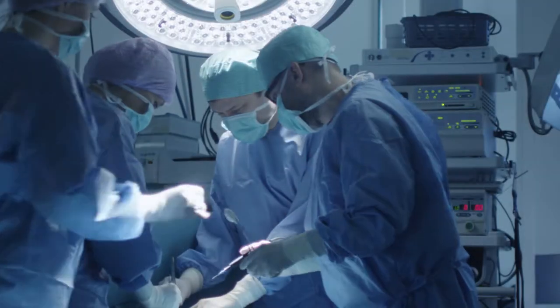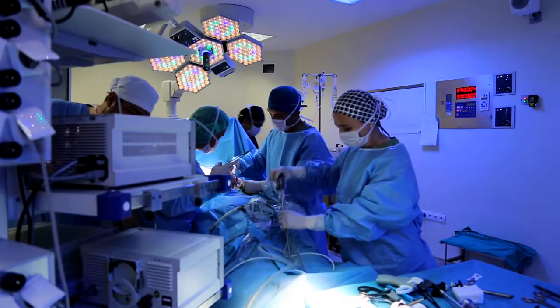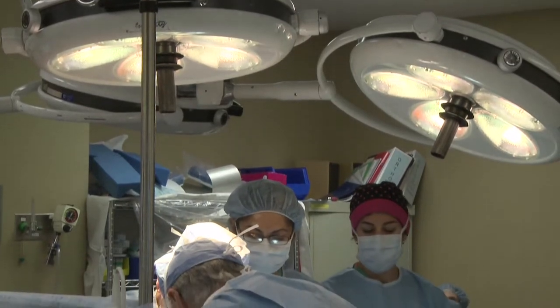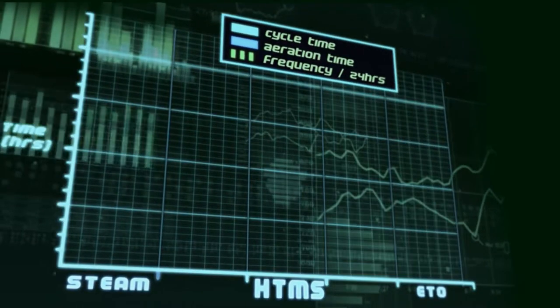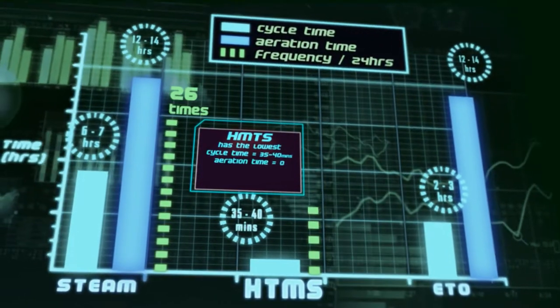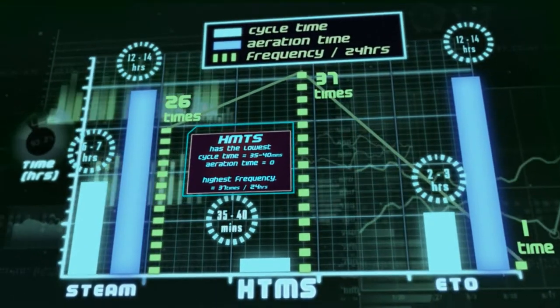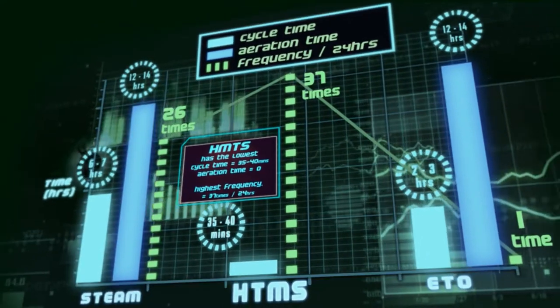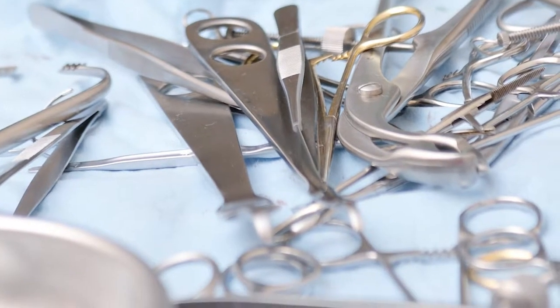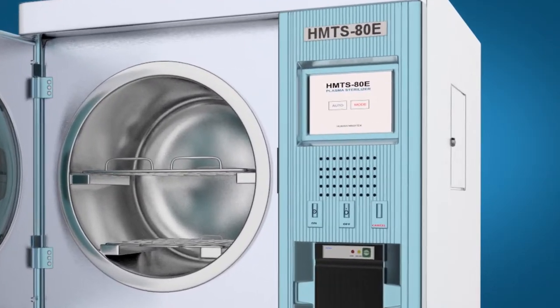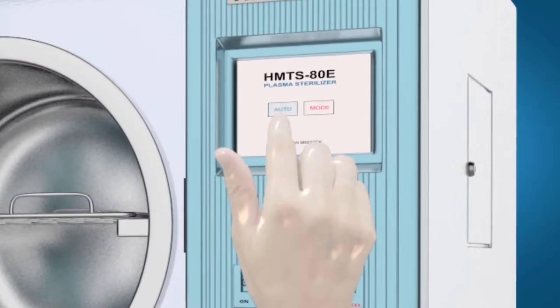Today's medical industry, where minimally invasive surgeries are becoming an increasing trend, HMTS offers the best possible solution. Its 35-40 minute cycle time allows different kinds of instruments to be sterilized all at the same time. No more tedious setting up of cycles and time-consuming segregation of different instruments. Simply press start and the machine will automatically begin the process.